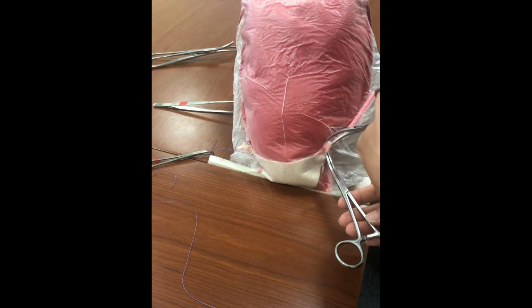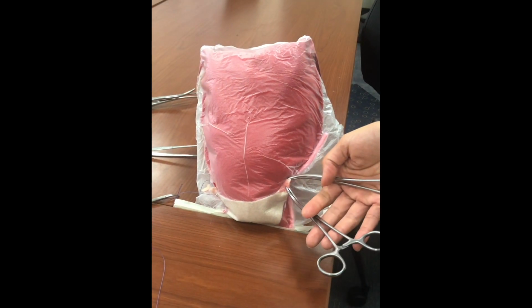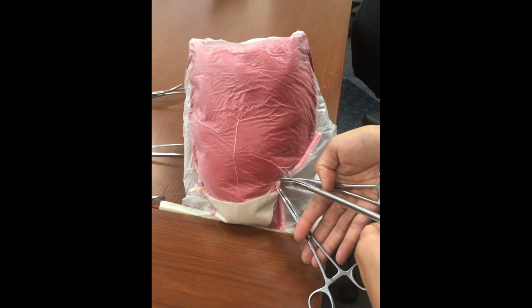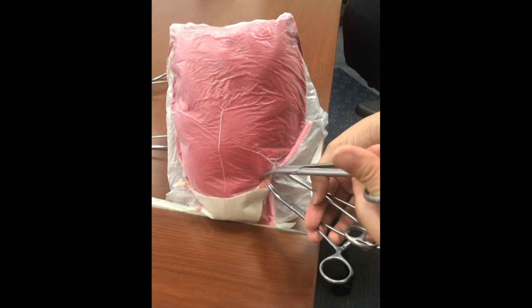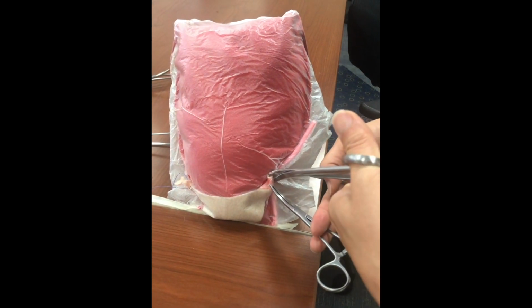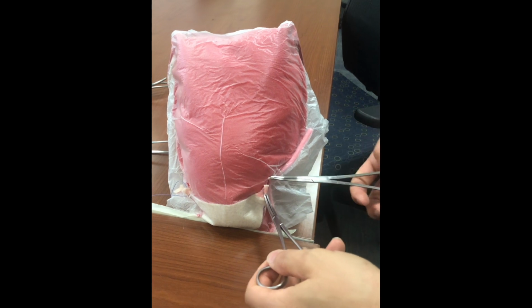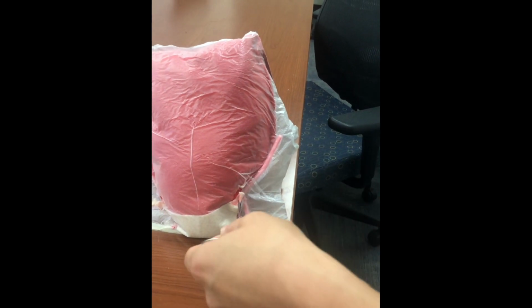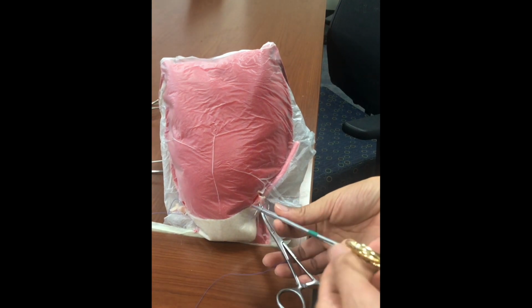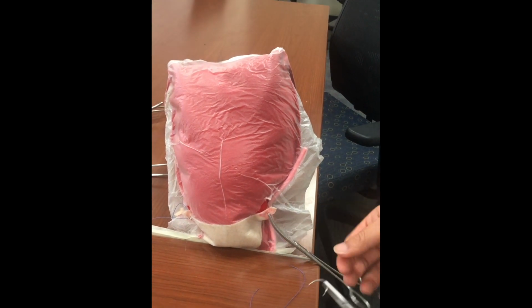First, identify the round ligaments to be clamped and divided. Use 2 Kelly clamps with the tips pointed toward each other. The tissue between the clamps is divided using Mayo scissors. One side will be toward the peritoneum that you've released, and the other side you will hold on to. Then you will suture ligate with a Heaney tie. You will do this to the other round ligament on the other side as well.